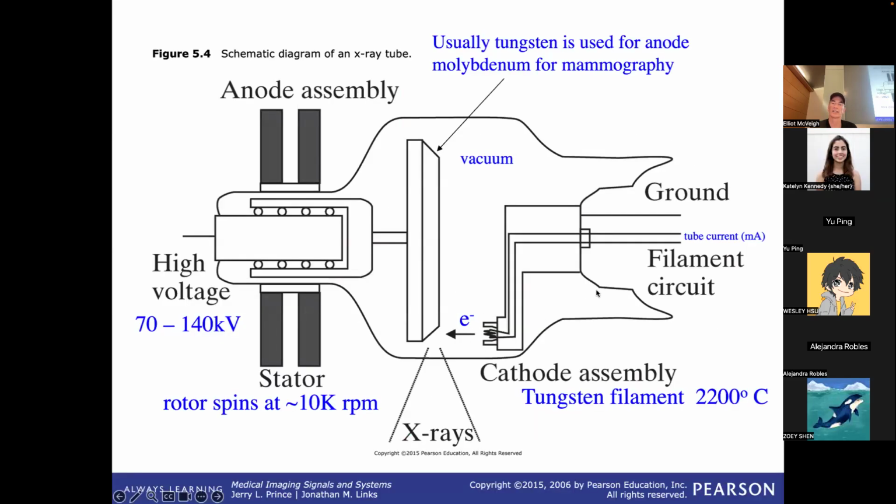So here are my electrons coming across. Let's say I set this to 100 kilovolts between here and here. They accelerate to a certain velocity by the time they hit the target, and that's set by the 100 kilovolts. And you'll do this in the problem set. It's not a small velocity. By the time they get across there, they are really flying, okay? I won't give you the answer because when you do it, you go, that can't be right, and you do it again. So they fly across there, and that sets the maximum energy possible for a photon coming out of here, if all of that energy got turned into one photon. If I want twice as many photons, I can change the current here by a factor of 2, put it up, and I'll get twice as many photons with the same energy spectrum, right?